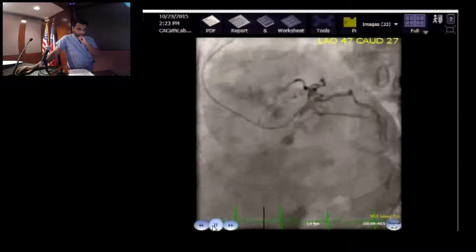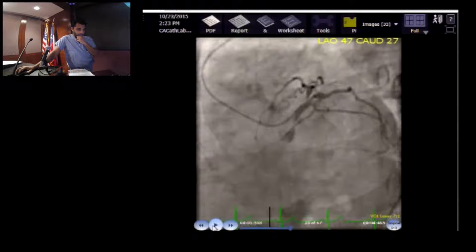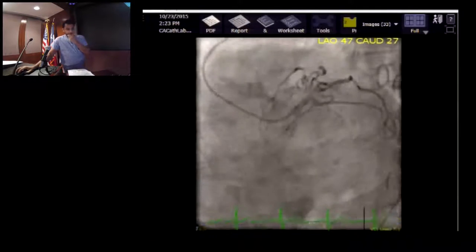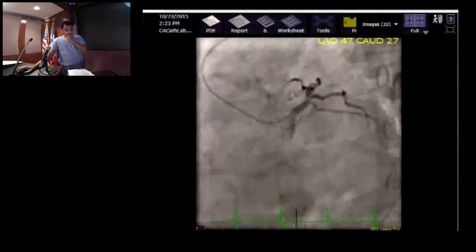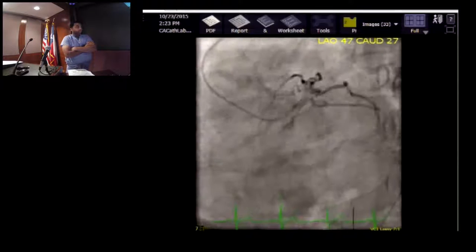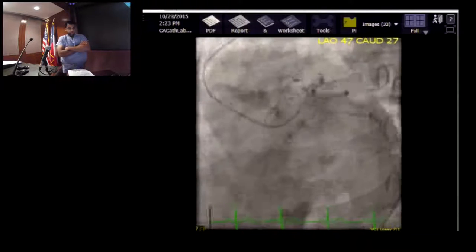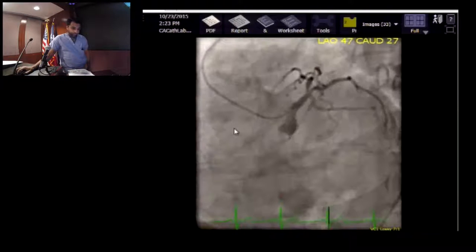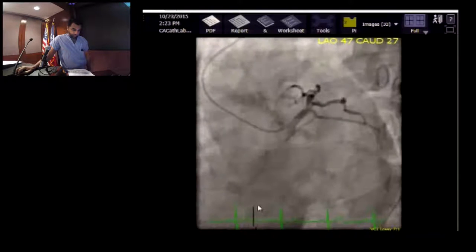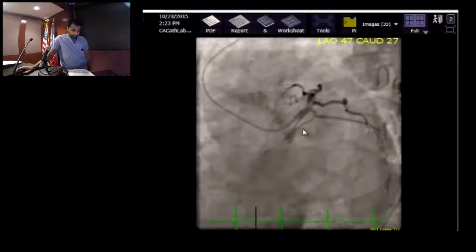Now you're seeing the proximal LAD. How many branches do you see here? You see three major branches. Right where you see it bifurcating, it looks a little suspicious. Is there something in the left main? It's not in the ostium, but when you look distally in the left main, there is. It looks suspicious. I would want to see it better in other shots as well. So make sure to identify and watch all the branches.